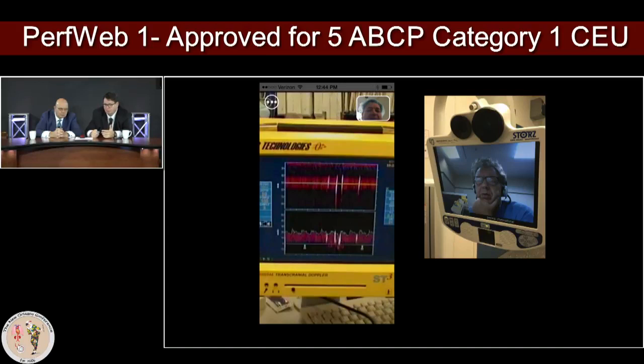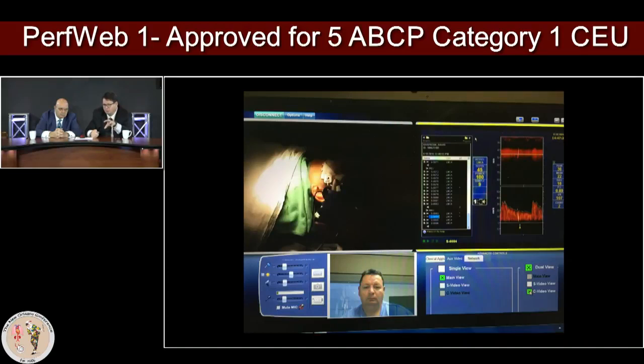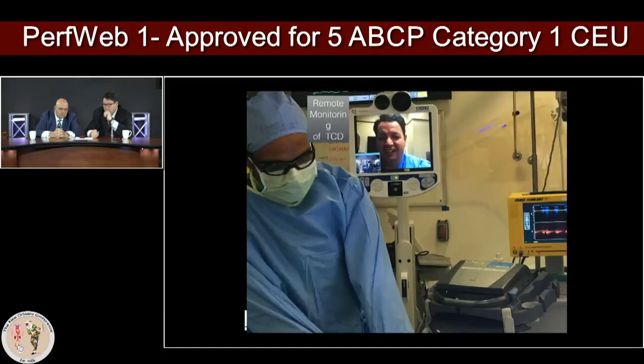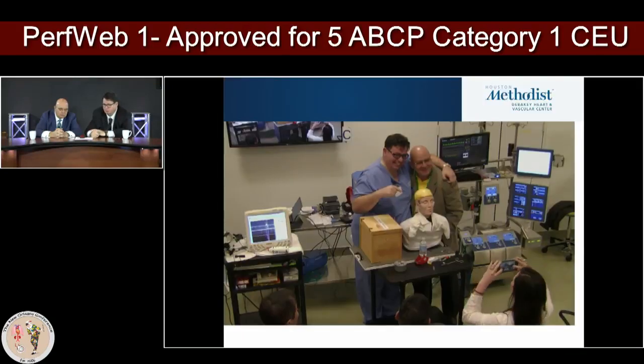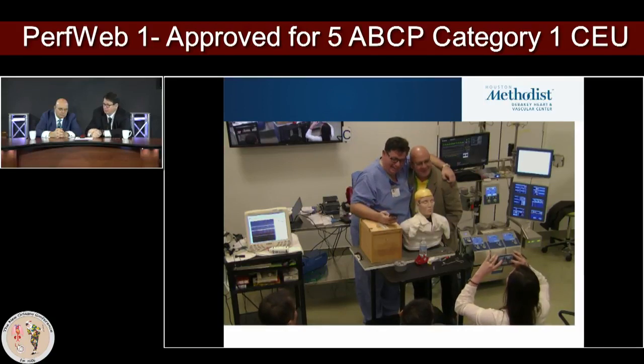Can you advance, Roger, please? So this is the TCD device in the operating room, and this is what I'm remotely able to control. And this is my remote view, where I'm able to see the operating field and also the TCD. And this is my head just behind the surgeon, to be able to present from hundreds of kilometers away and remotely assist.